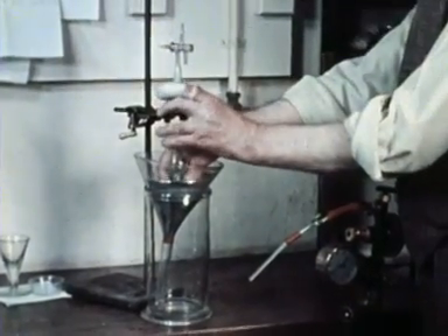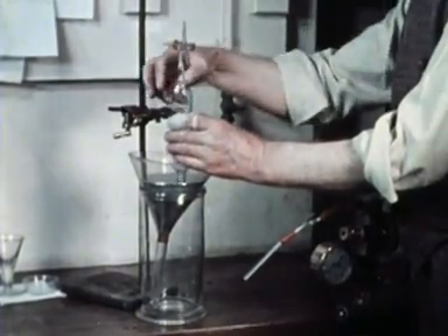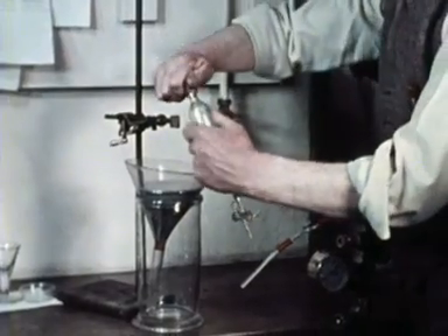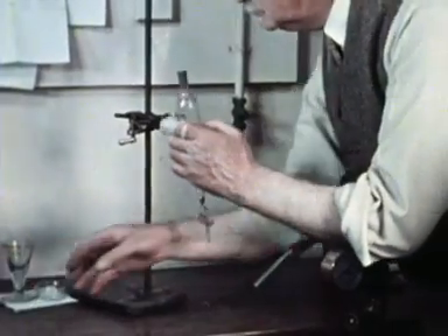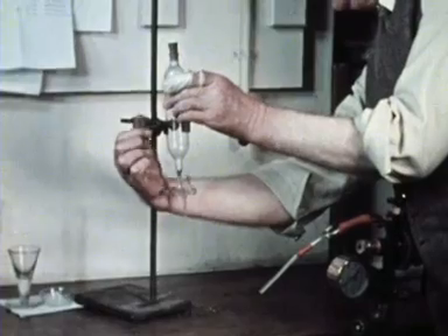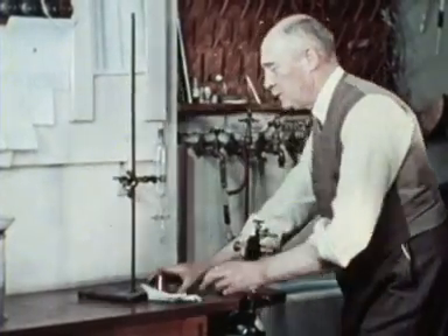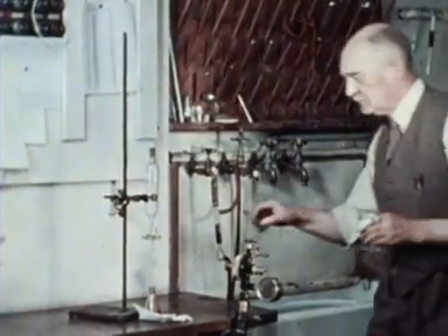Now he has a tonometer filled with nitrogen. His test sample is probably blood which he will already have defibrinated by whipping with a feather or a wire brush.